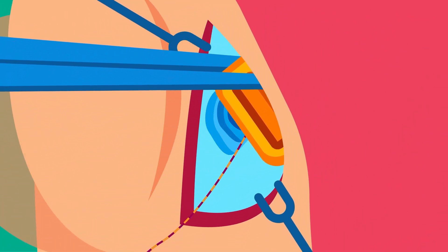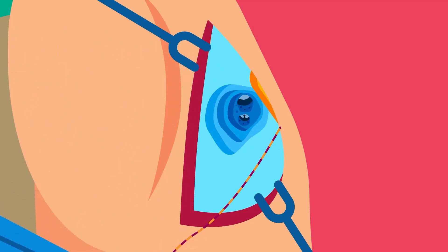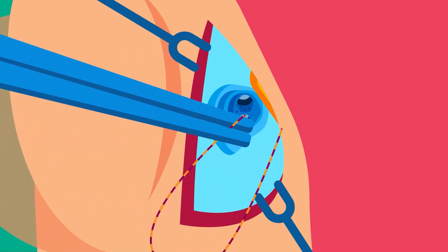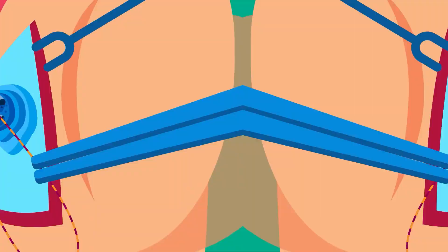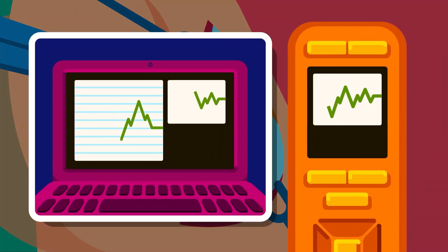The receiver is put on the opening and the electrode is inserted as slowly as possible to prevent damage to the cochlea. Once the electrode is in place, its position and integrity is further confirmed by intraoperative telemetry.